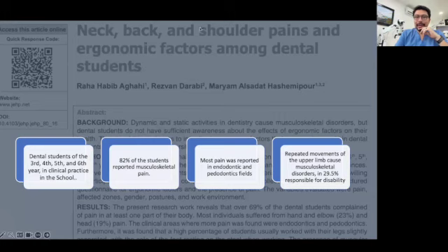And what areas of dentistry are the most affected? Endodontics and pedodontics. Endo, why? Because it's difficult to see inside of the root canal system. And in pedodontics, they have to work very fast. If you have a 2 years old little kid in your dental chair, you cannot spend 60 minutes with him or with her. You need to work very fast. And most of the pediatric dentists have to work very fast and need to adapt bad positions for having a proper vision in the area.